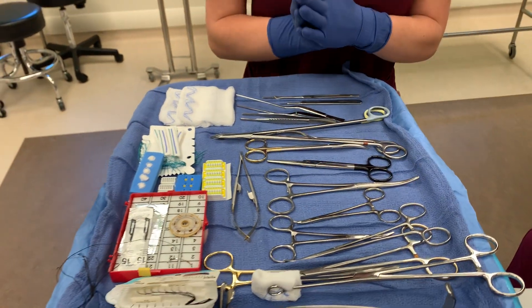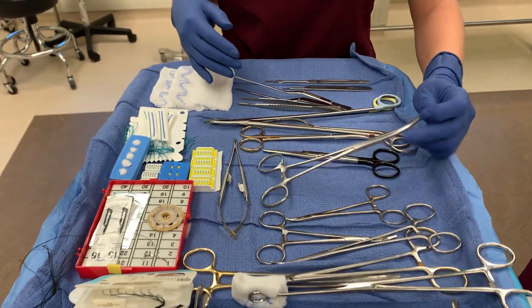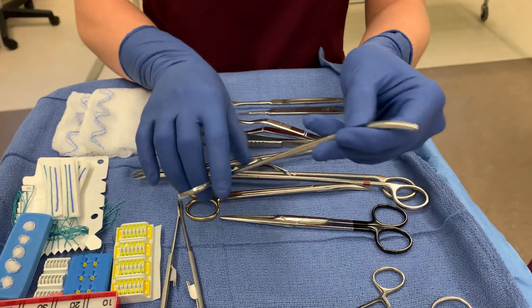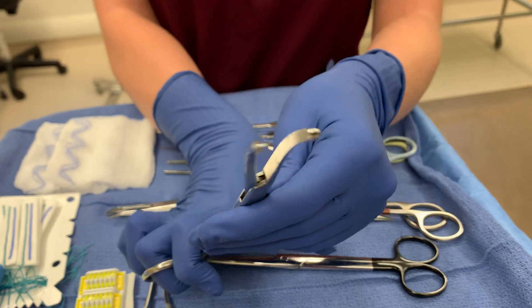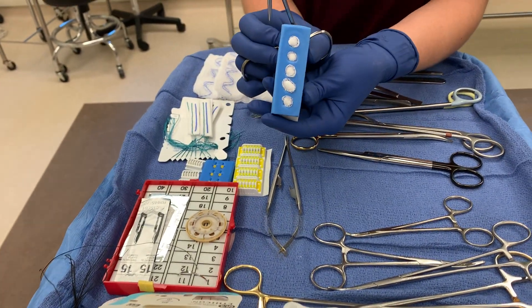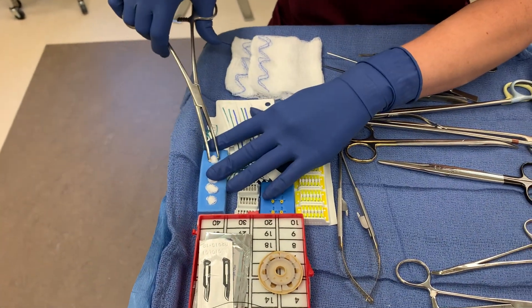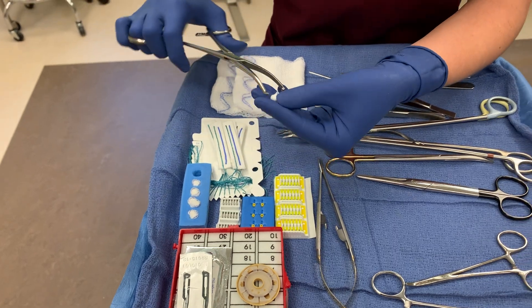Next we're going to go over loading a Kittener. Which instrument would you need to load a Kittener? You would need an Ochsner or a Coker — with that tooth. Your Kitteners come like this in the package, and they'll usually be stuck to your mayo or back table. I'm going to grasp it with the Ochsner.